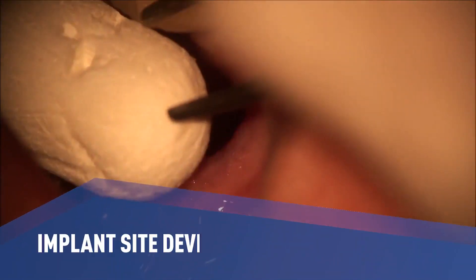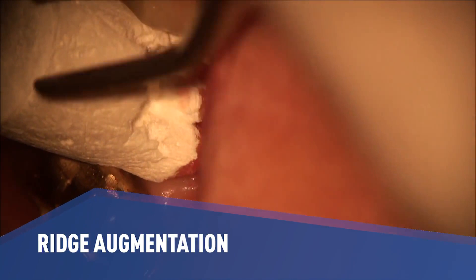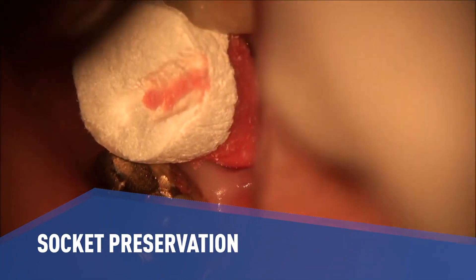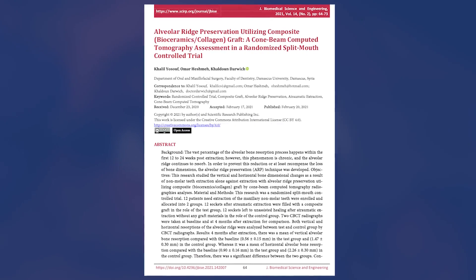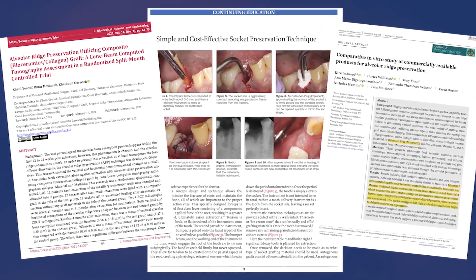I use Osteogen Plugs routinely in practice for implant site development and for ridge augmentation and preservation for future fixed partial dentures. Intact sockets are fully converted to mineralized bone in six to eight months. In independent tests, Osteogen demonstrated significantly better biocompatibility than similar bone grafting solutions.